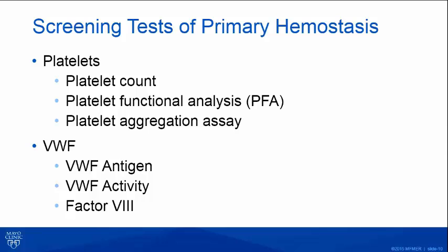So one word of caution is that the platelet functional analysis, the PFA-100 and aggregation assay, is a live functional test, so it requires live platelets. And so the assay has to be finished within 4 hours of sample collection, so it's usually performed locally.